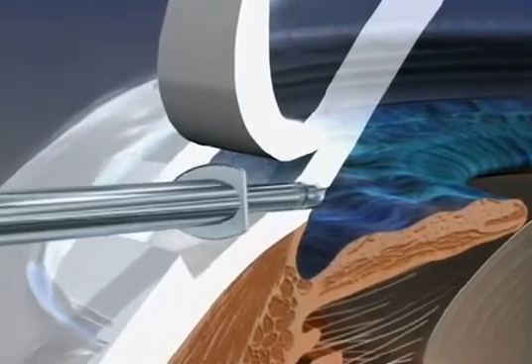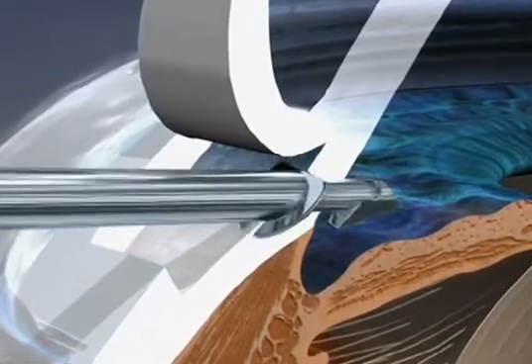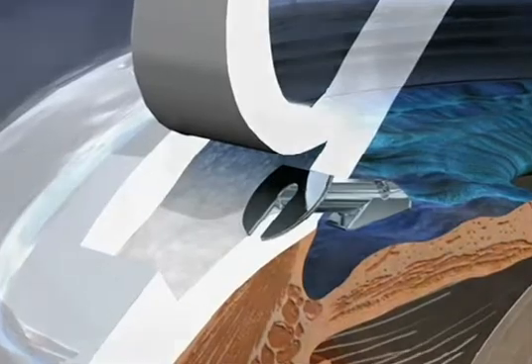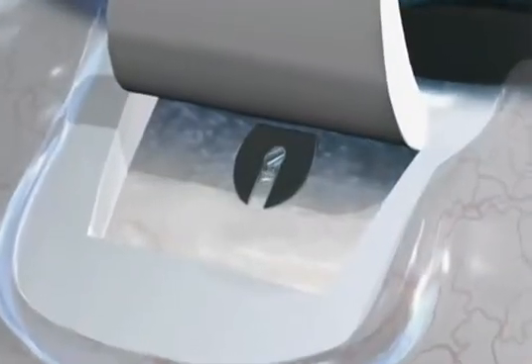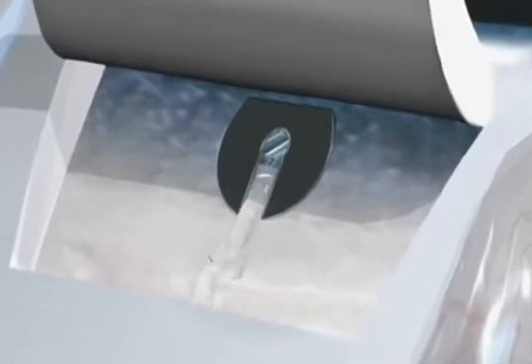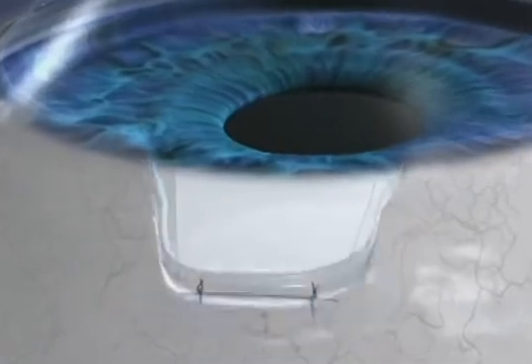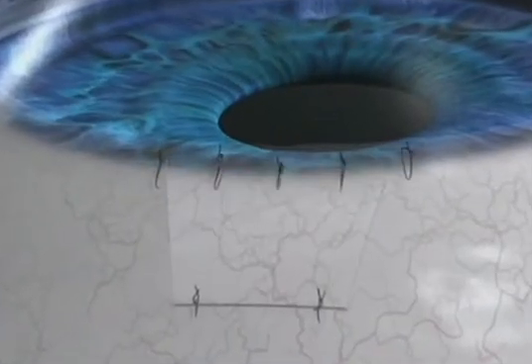This is the P shunt being placed with an inserter into the anterior chamber, rotated so the spur hits the cornea and it is absolutely flat on the sclera. The P variety has an opening in the posterior segment of the shunt that allows for immediate fluid to leave the anterior chamber. It is then closed and the procedure is over.